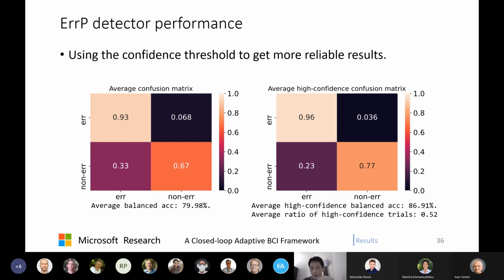If we add wrong labels into the training pool, we can easily ruin the model. But with the relatively low false negative rate, although we are missing some trials because of the false positives here, we can avoid the risk of ruining the model.